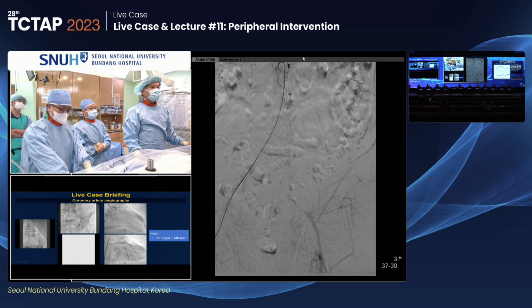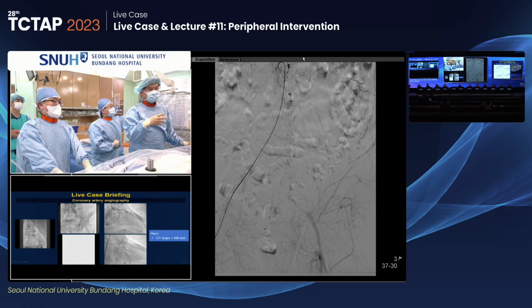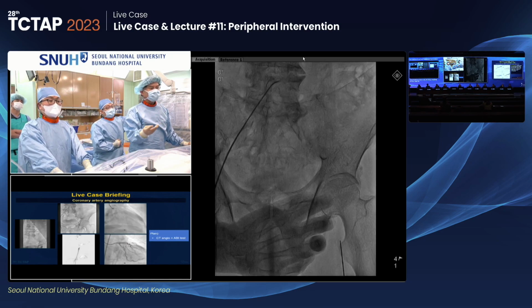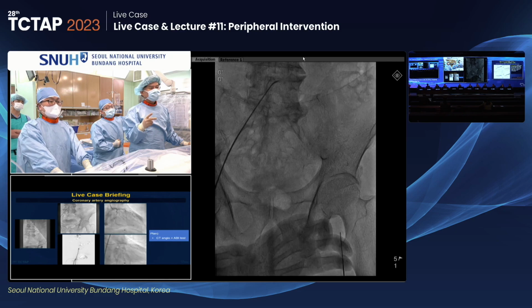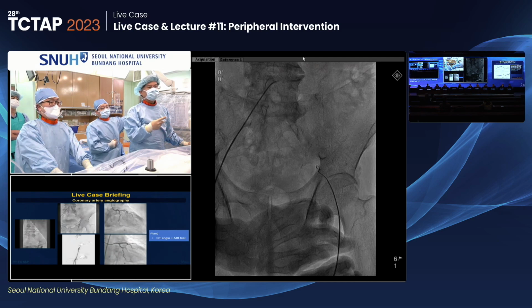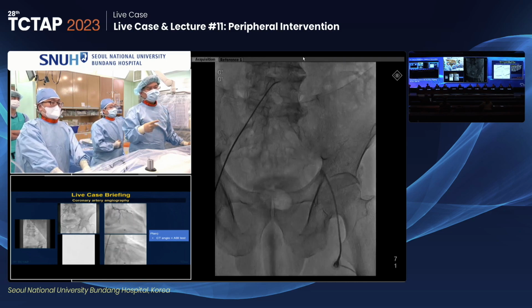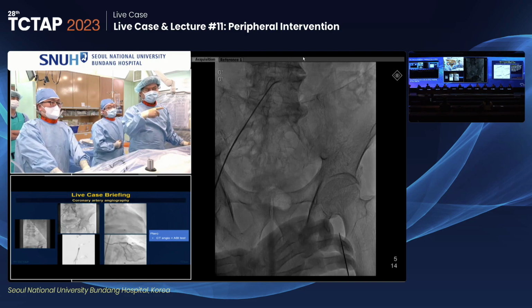So immediately after I arrived here, I took oblique views, because they didn't take the LAO and RAO oblique views. The problem is also that puncture is another issue. We can do a sonoguided puncture or fluoroscopic demarcation observing the fluoroscopic calcium. Fluoroscopic calcification, negative.